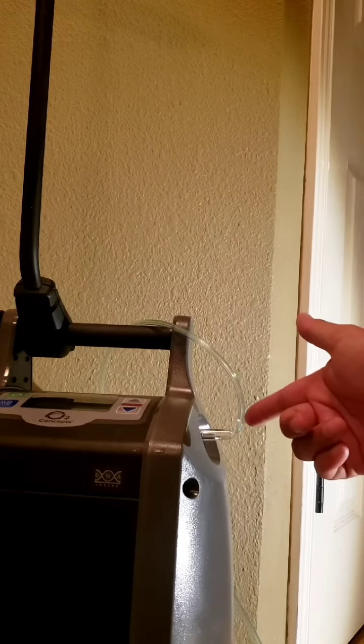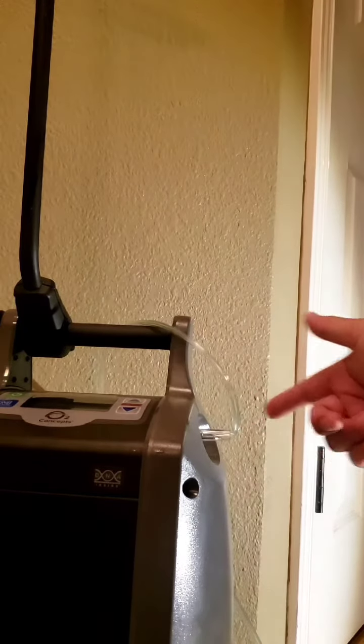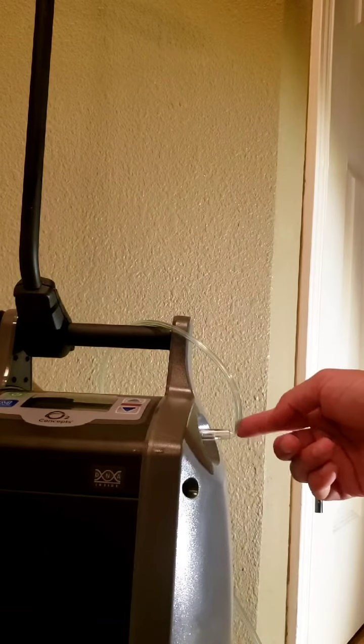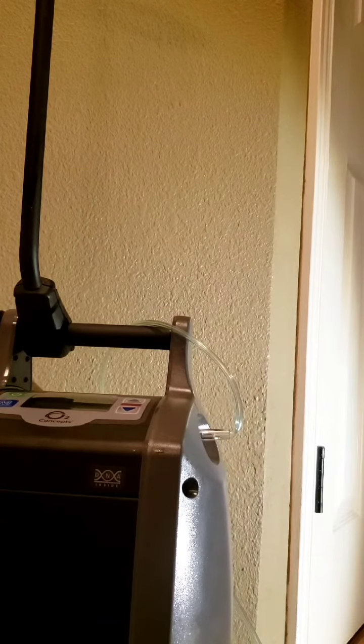As you can see on this one, the cannula has developed a kink right at the connection site.